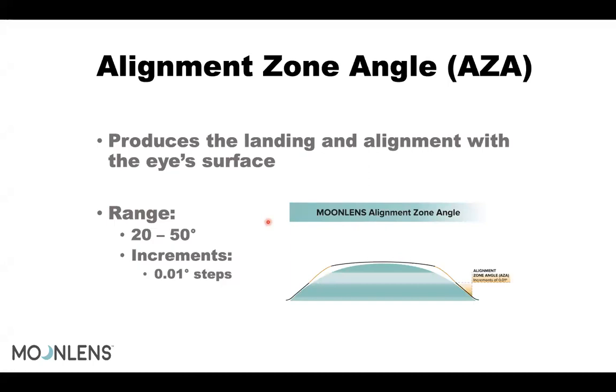So that is why it's very important to know how much difference we have at the 8mm chord, just to determine what type of lens we are getting. And you can see that with the eccentricity values that we were talking about a little before with the calculator.